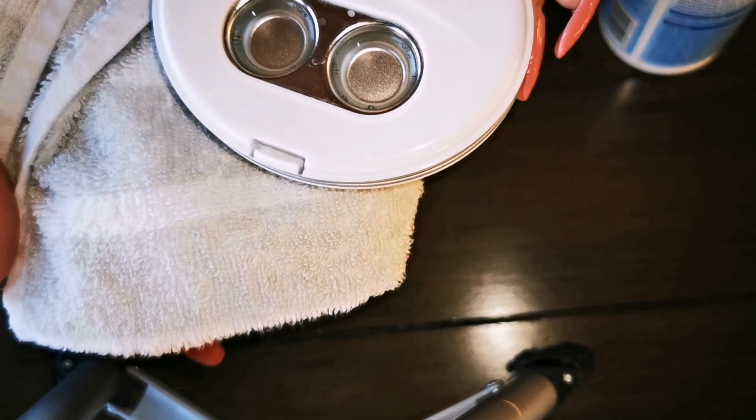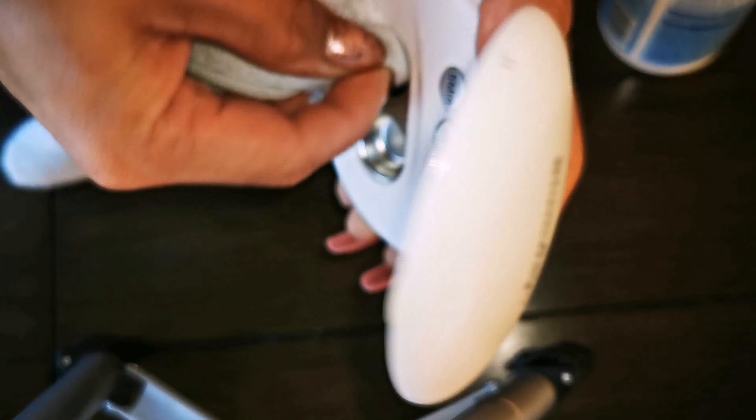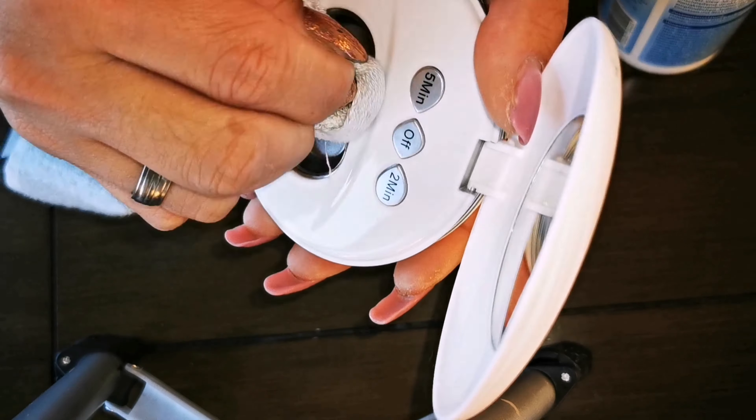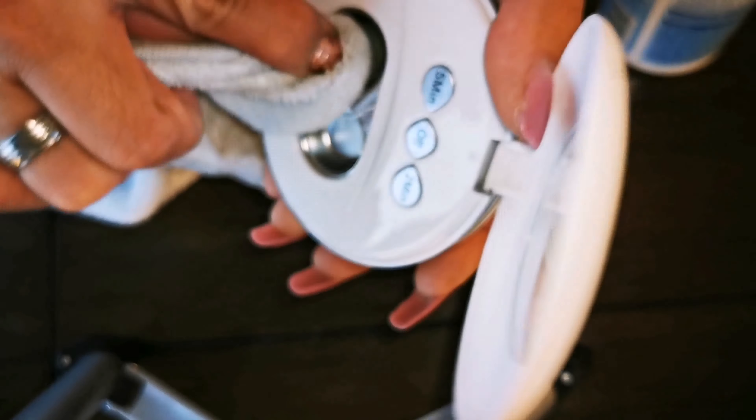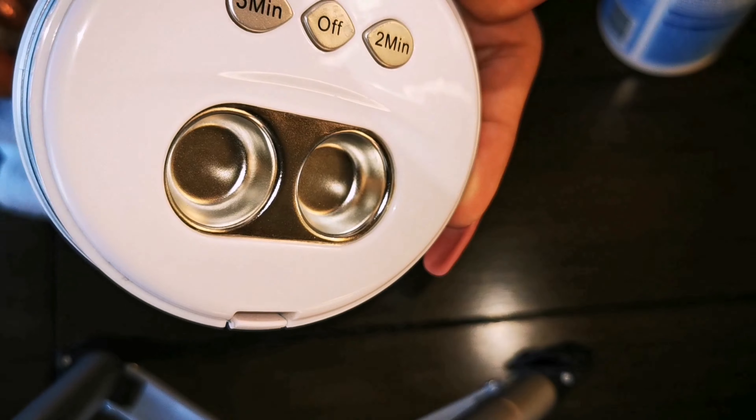Normally you do this every day. Take an absorbent towel, place it there, and scrub all the liquid until it's dry. Don't wait for the liquid to dry by itself because it's going to build up again. Clean everything and don't smudge the liquid all over the surface — you don't want buildup all over your device. That's how it should be done every day.